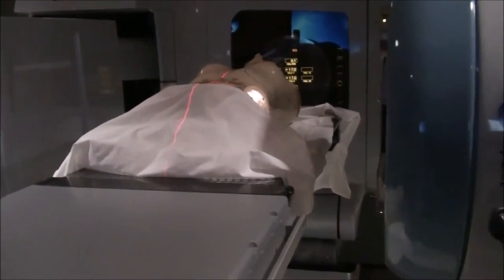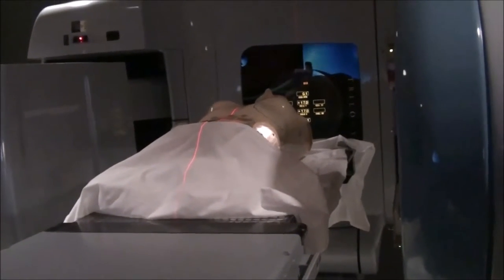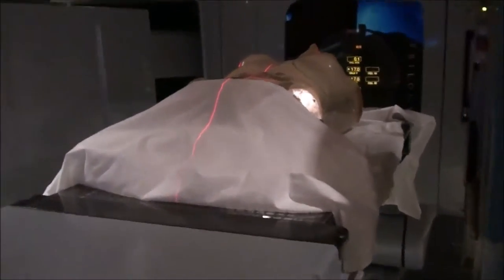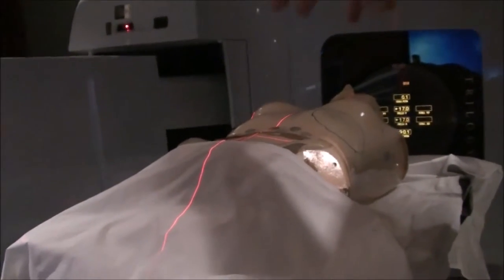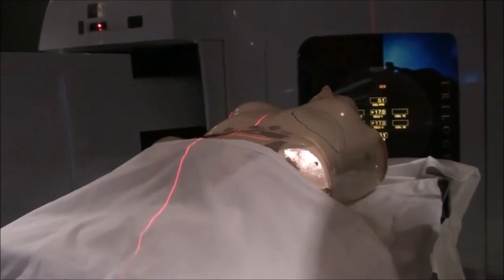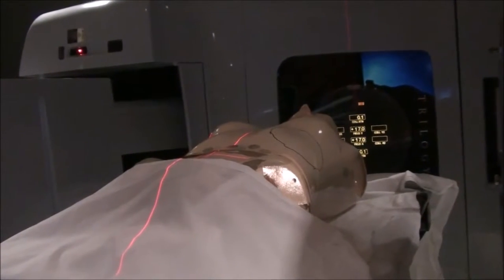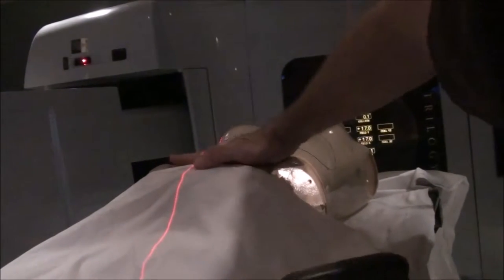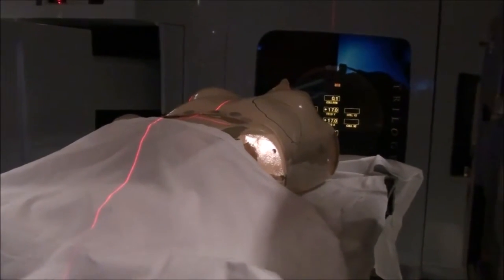The field size is going to be what the doctor sets. Once you get to the lateral, go straight out of the room and fluoro again, then set your depth on fluoro. Once you have the depth set, call the doctor — the doctor will come in and make adjustments. If they move up two centimeters, we don't want to have made any other marks on the anterior, because your divergence as projected on your patient is going to change since the anterior will now be closer to the target. Once the doctor moves the patient and says that's good, make absolutely certain they don't move left, right, or in and out — up and down is the only move. Then notate everything including the vertical on your anterior setup sheet.